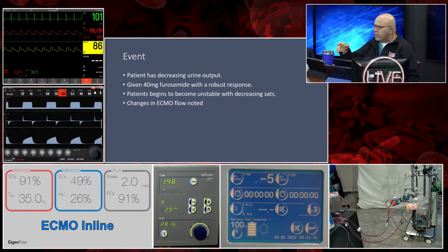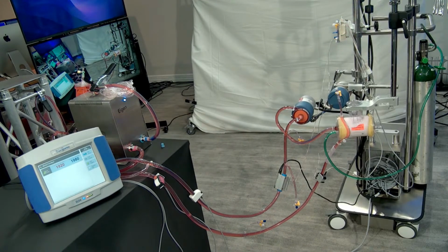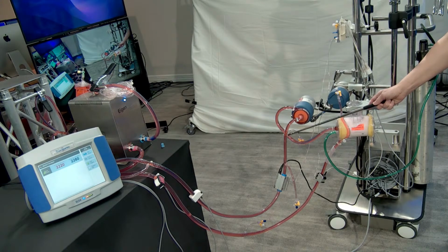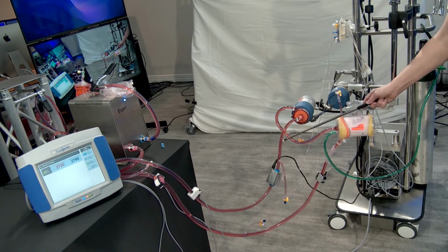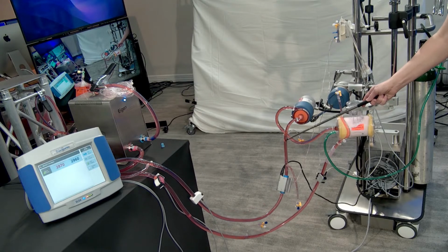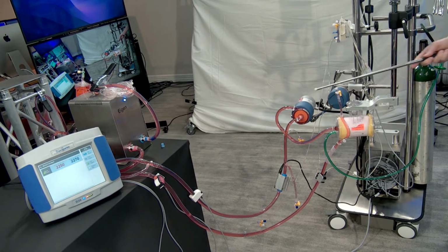I don't know if you can see it or not, but can you go to full screen on the entire circuit? Can you see if the line appears to be, if you're seeing any chatter? Because a lot of times you will see that. Maybe you can simulate it. Yeah, you will see a lot like this. Chattering, yes. And it's doing a little dance because what's happening is because there's not enough volume at the cannula, the line is collapsing because the pump is pulling more volume than is available. Go ahead and stop the sounds.